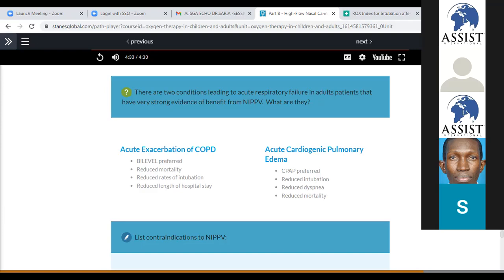especially expiration. So the same way, one of the challenges we're getting with CPAP is patients are breathing at constant pressure, and somehow, some way, it's uncomfortable, more compared to NIV or non-invasive positive pressure ventilation, of which here the difference is you will set two pressures, the inspiratory pressure and expiratory pressure at different levels, so that one is high inspiratory and the expiratory is lower. Patient can breathe in and out during these two different pressures, and it becomes a little bit much better for them and comfortable.